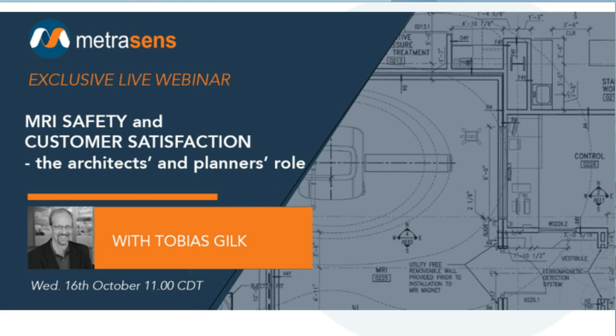itself. So, no, don't put it on the inside of the room, period, end of statement. Do put it on the outside, and to the extent that you can, create that separation distance using the thickened wall technique to put the detector a minimum of 16 inches, hopefully, in front of the position of the door into the MRI scan room. It gets you better functional results.